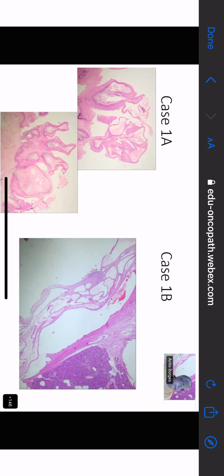Yeah, Vimi, why do we make a description? Ma'am, it is to have a good observation about the tissue, what we are seeing, and to know the normal and what is the pathology, and give a good description about. Very good, excellent. All right, anybody else has got any other thoughts?